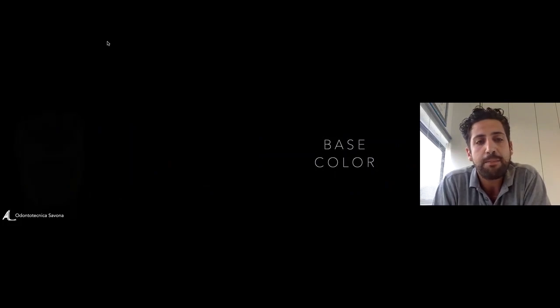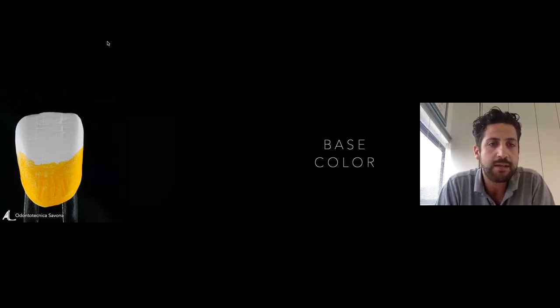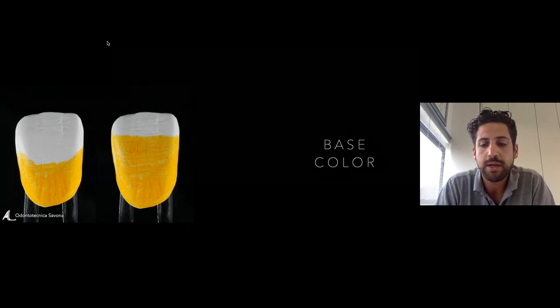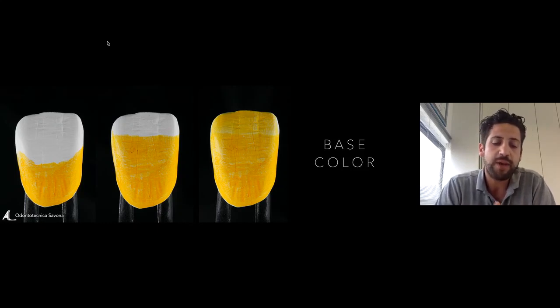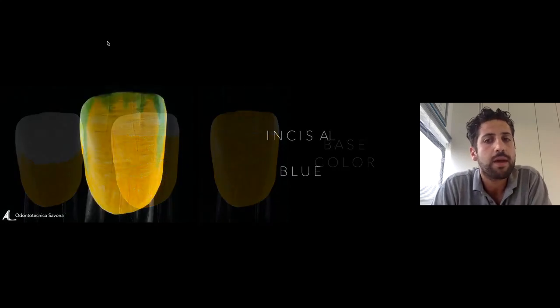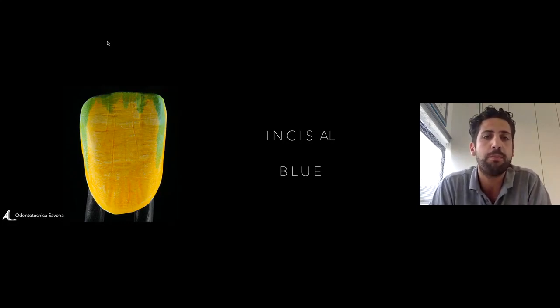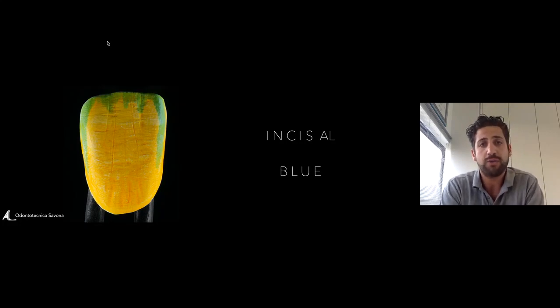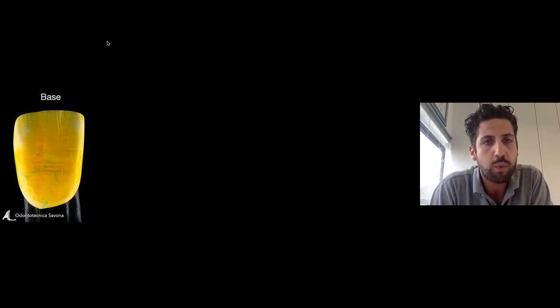But let's see the technique for the infiltration. The technique is still the same as the oldest Prettau, the traditional Prettau. I made 4 steps on the cervical side, 3 steps in the middle, and 1 step in the incisal edge. That's to make the passage of the color between cervical and incisal. In the incisal edge, for the younger tooth, we just put blue, no more, because if we start to put more color, the value of the tooth starts to go down, and this is a big mistake.